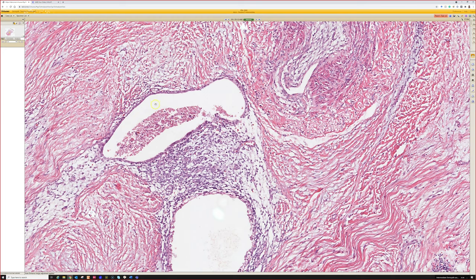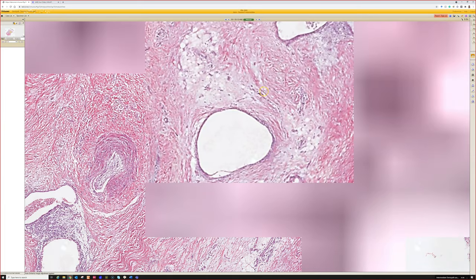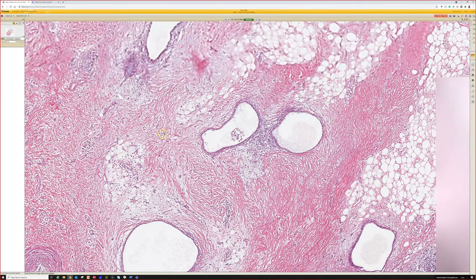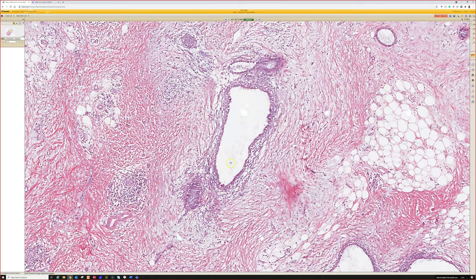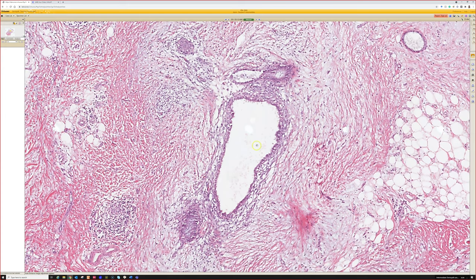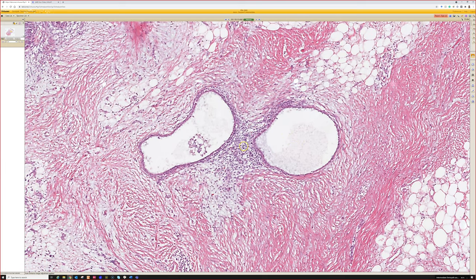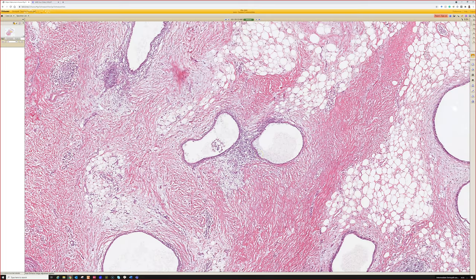So, you know, again, if you're having a bad day, you can start thinking of colon cancer, things like that, and you don't want to make that mistake. Usually when I see these, it's in the abdominal wall in the scar from a C-section, but you can also see them in the vulva and in other places as well. And when patients are on progesterone, they can get decidualization, which can make the stroma and the lining cells look very weird and strange and very atypical. I've rarely seen very dramatic cases of that, but I've seen examples in study sets that were pretty scary looking. So important to remember that.